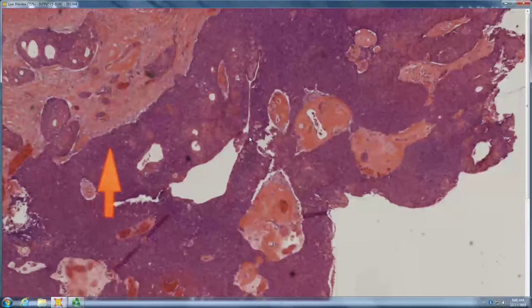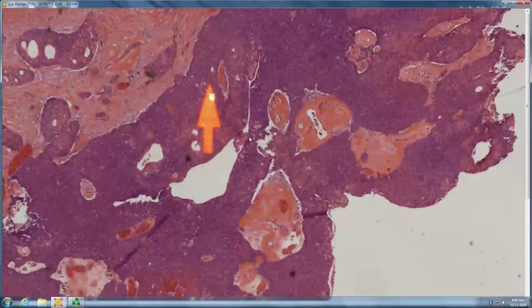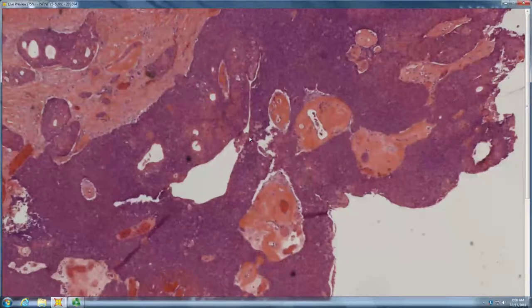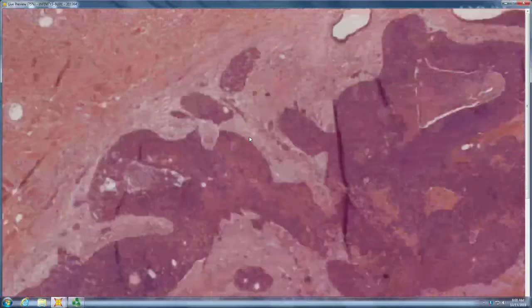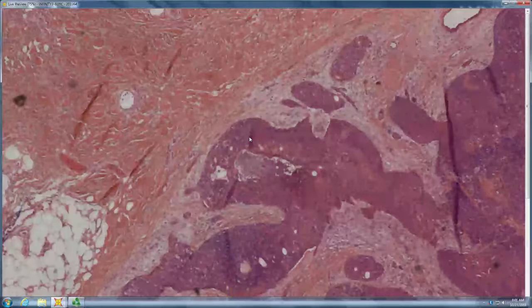Anything in the acrospiroma poroma group, they never palisade. Right, so you never have palisading. You typically have little round, clear spaces. If it has cellularity like the normal acrosyringium, it's benign. If they're packed blue nuclei, as this has in areas, then you start worrying about porocarcinoma. So this probably has porocarcinomatous change in it, where it becomes just too blue. Right? Too many nuclei.